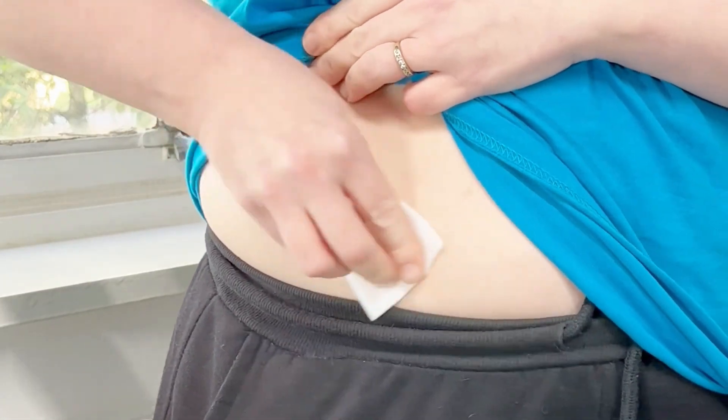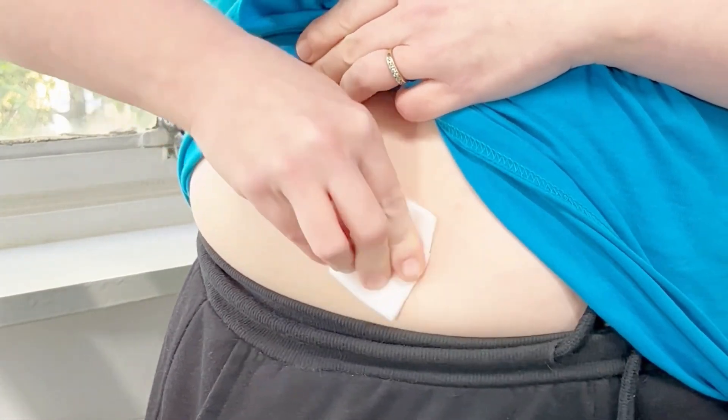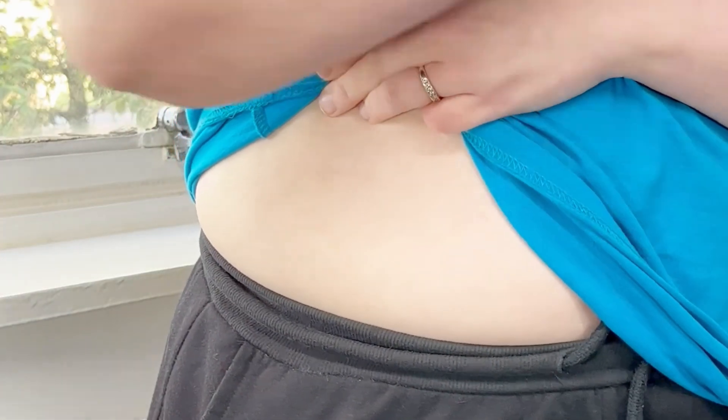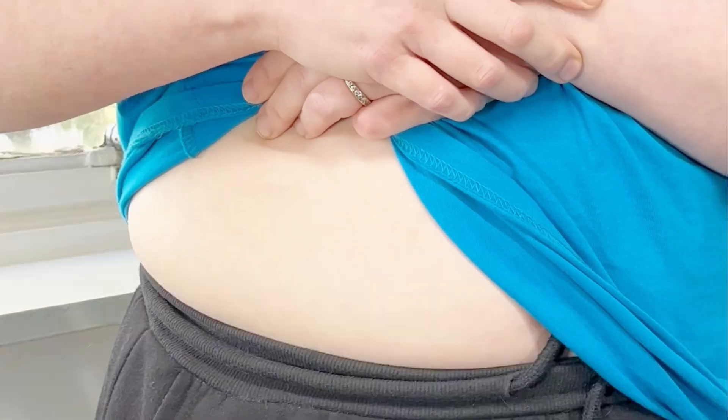Wash your hands, then make sure to clean the injection site with soap and water or an alcohol swab, and do not touch the area after cleaning.